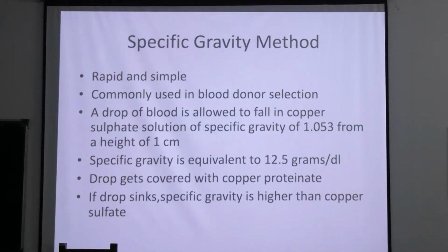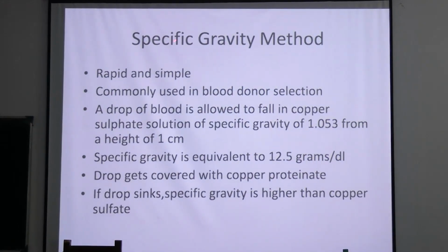Otherwise it is not used for routine purposes in the lab. Its importance is only in blood donation camps. In the copper sulfate method, you have to remember this thing.